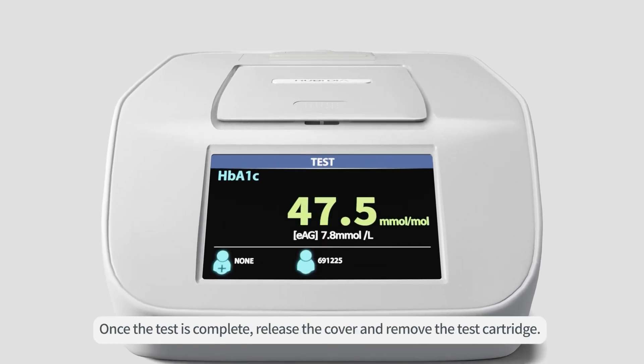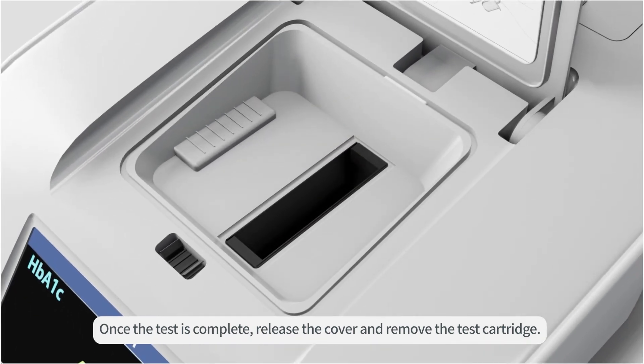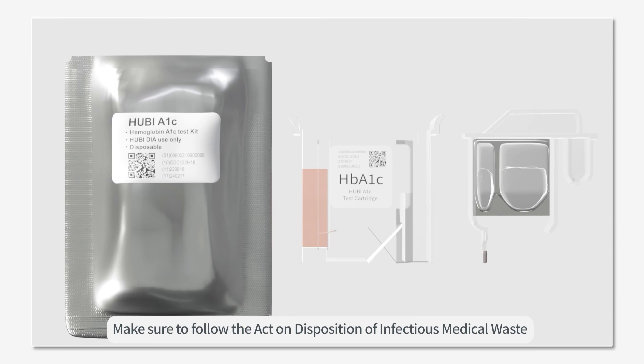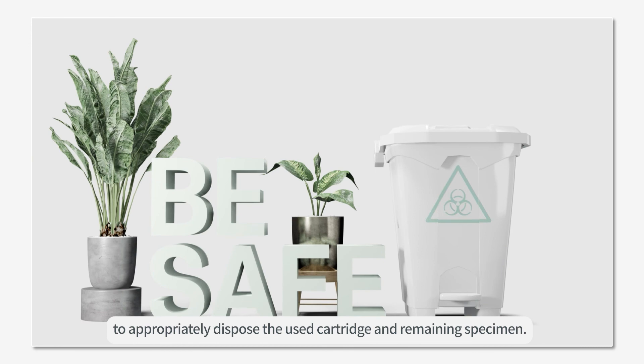Once the test is complete, release the cover and remove the test cartridge. Make sure to follow the act on disposition of infectious medical waste to appropriately dispose the used cartridge and remaining specimen.